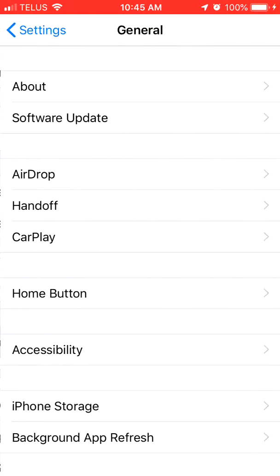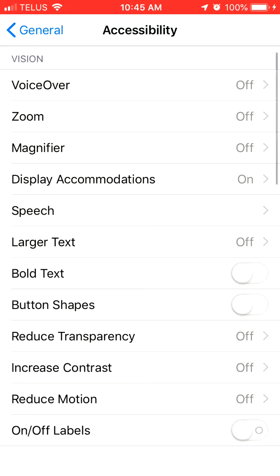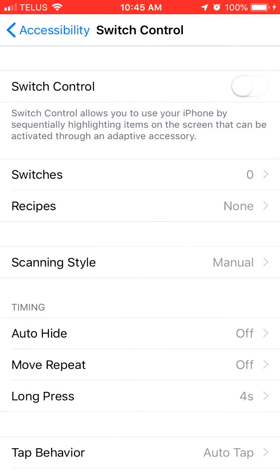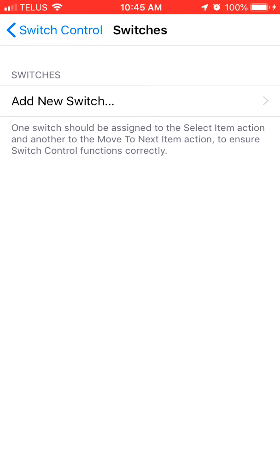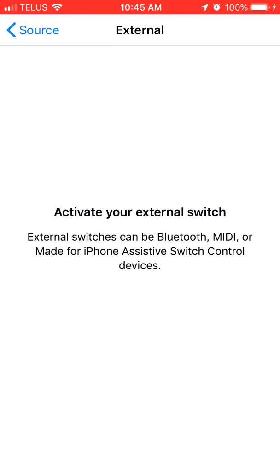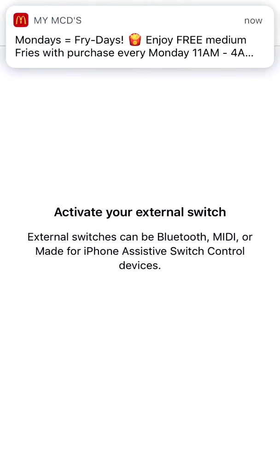In order to do that, you need to go to Settings, General, Accessibility, Switch Control, and then to Switches. Add new switch, and because the VISAIDE Smart Cane 5000's button interface is an external device compared to the iPhone, you'll click External. Now it wants you to activate your external switch.